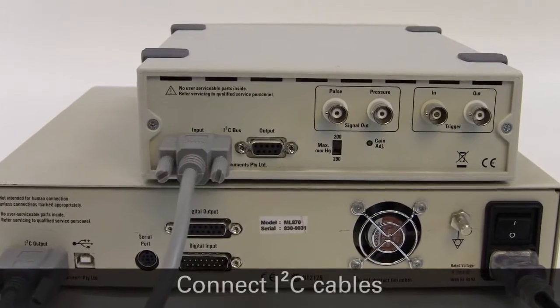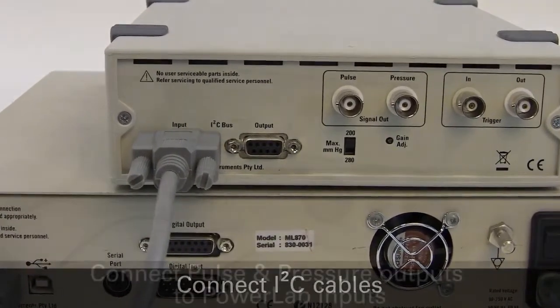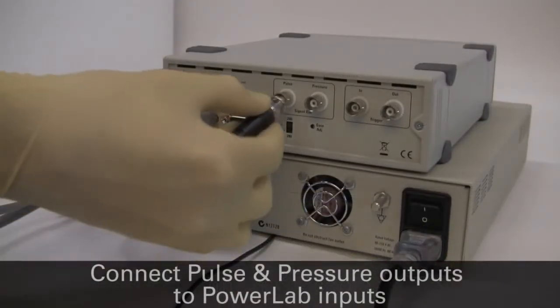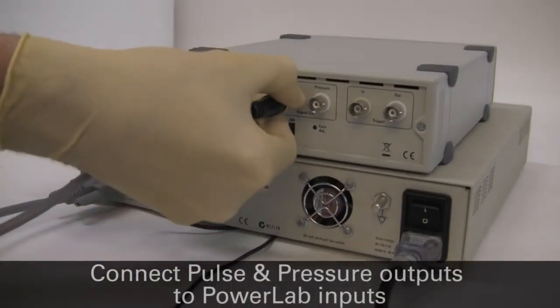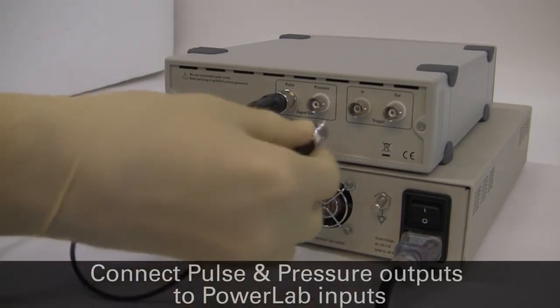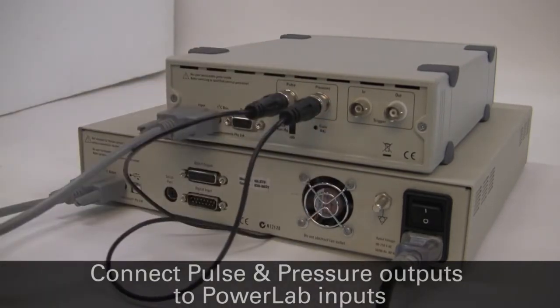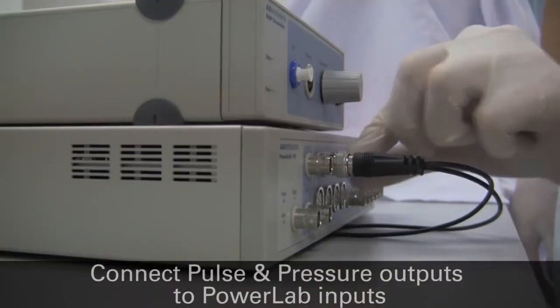Connect the I2C output of the PowerLab to the I2C input of the NIBP controller. With BNC cables, connect the pulse signal output on the back of the NIBP controller to one of the analog inputs on the front of the PowerLab, and connect the pressure signal output on the back of the NIBP controller to another of the analog inputs on the PowerLab.